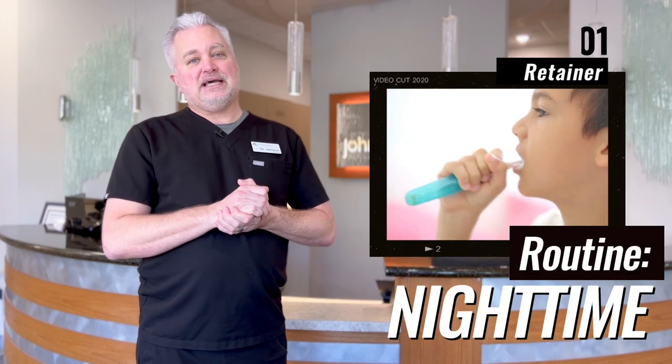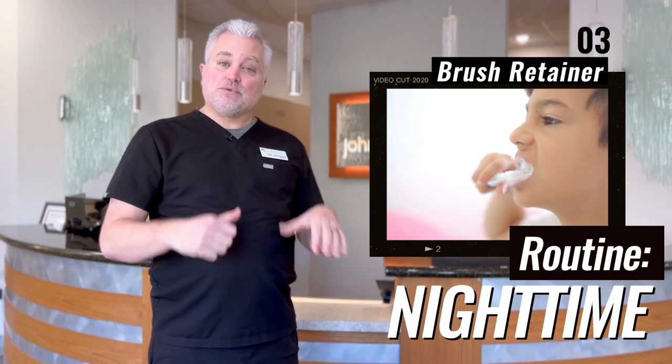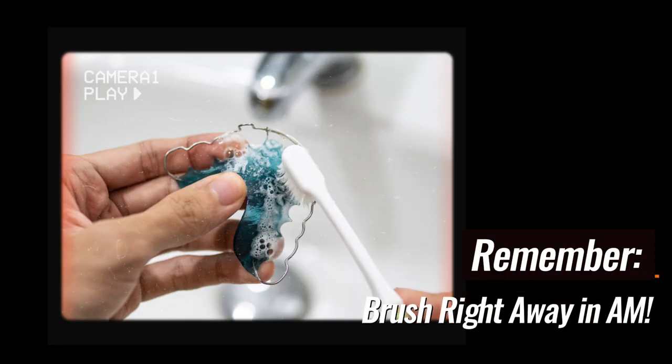When you take it out the next night, it's not a bad idea to brush your retainer before putting it back in. One of the big things to remember is to brush it as soon as you take it out in the morning, because some of the stuff in your saliva can get on your retainer, and if you let it dry it can turn into a hard substance that's harder to remove — so brush it immediately.